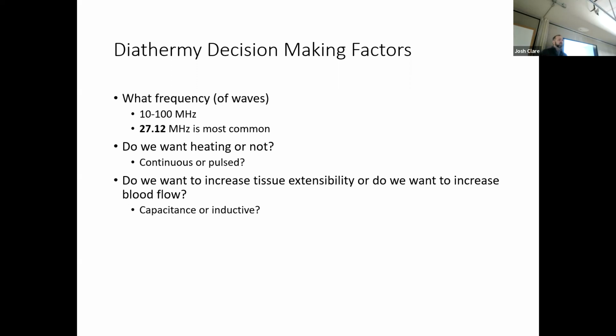Any reasons we would say, I'm looking at this, we don't want heating? Inflammation, yeah. First 72 hours after an injury, just off the bat. Anything else? Tell me why. Fevers, yeah, because fever is an early sign of potentially infection. Don't want that. Any other reasons you would want to stay away from heating? I think those are good ones. Edema, potentially. Edema, not necessarily don't do it, but acute inflammation, I do think.